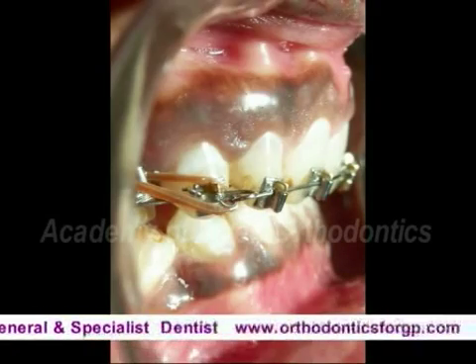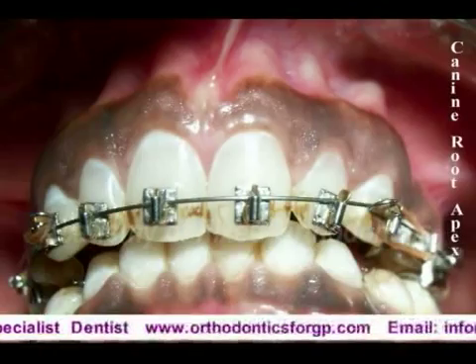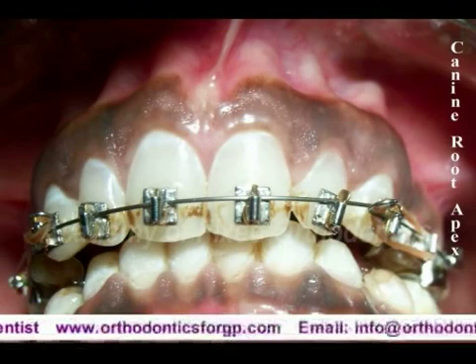This is the BEX at stage 2. Now for correction of torque you have to go for stage 3.